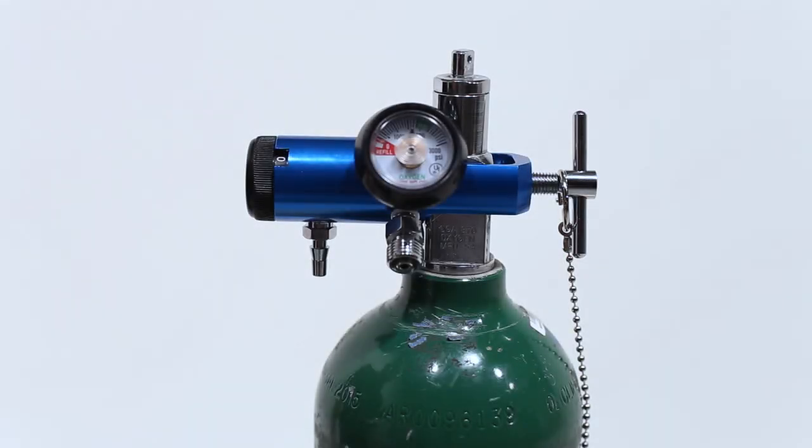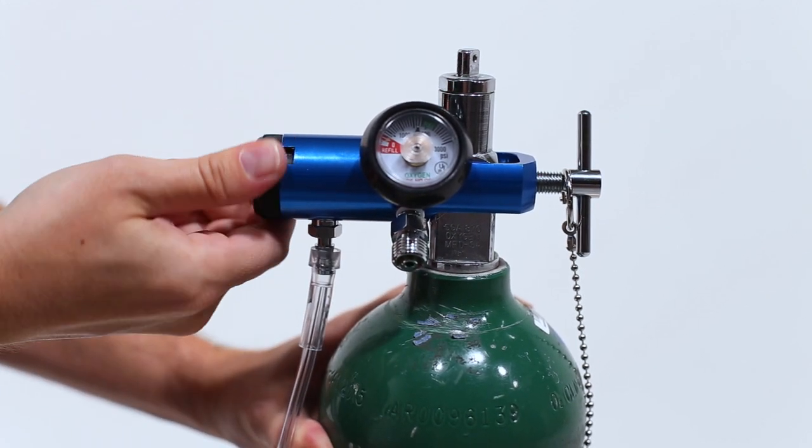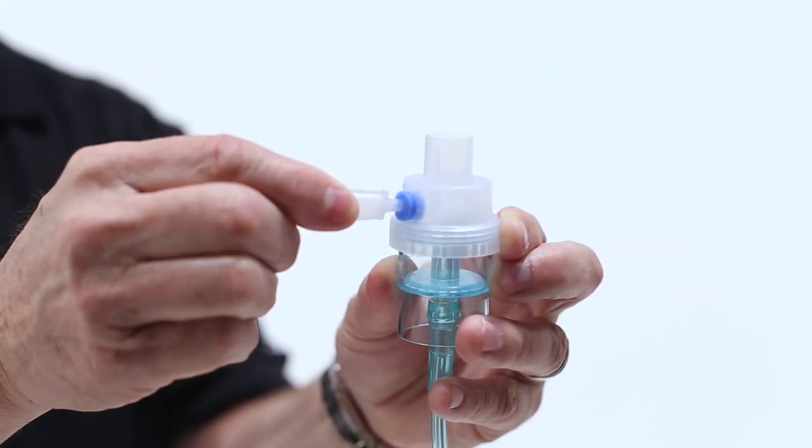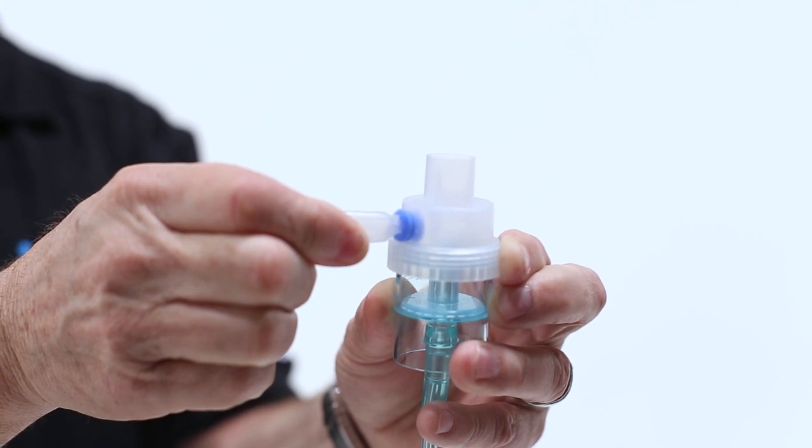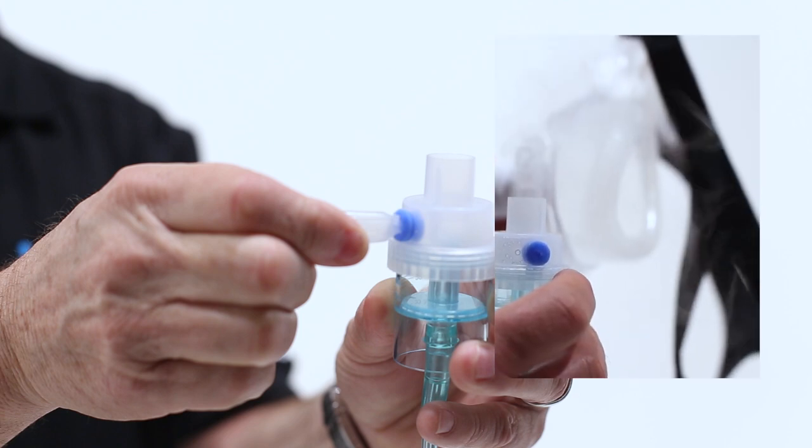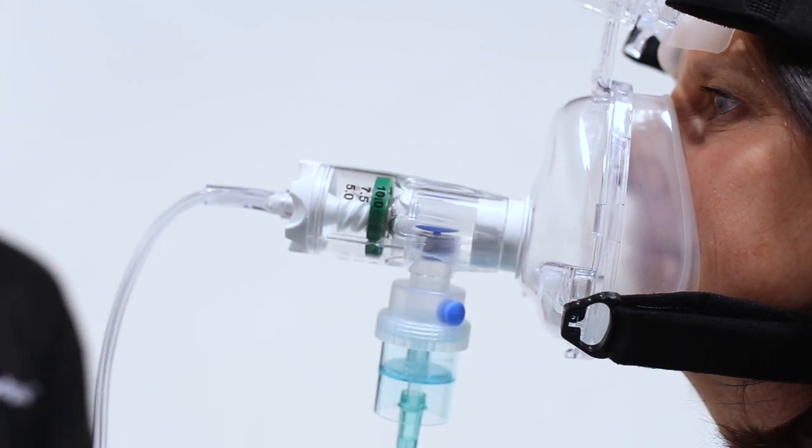If you choose to nebulize your patient, simply connect the supplied O2 tubing to a second oxygen source. Place your medication into the canister. You can use the top of the canister or the needleless entry port. Set your flow to 8 liters per minute. Once you see the flow of nebulization from the top of the canister, place the canister into the circuit and give it a slight twist.